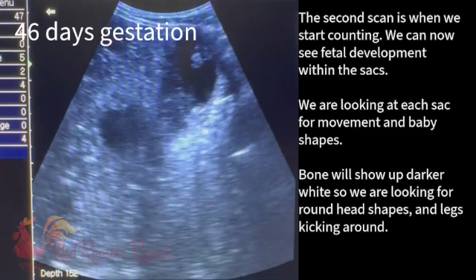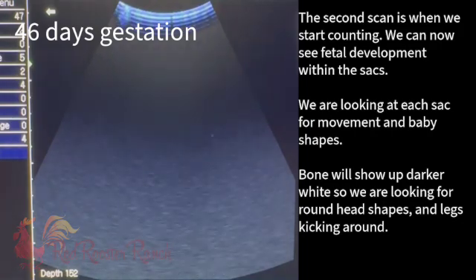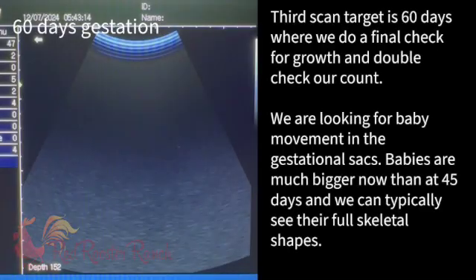Okay, I'll go ahead and turn it off. Looks like three babies — we'll know for sure in three and a half months. Bea Arthur bred to Ace of Diamonds.